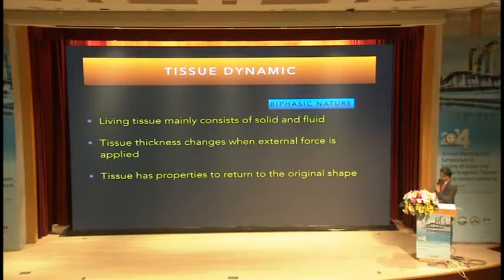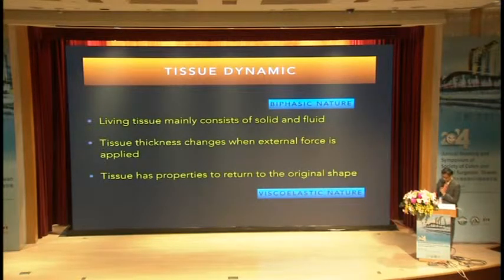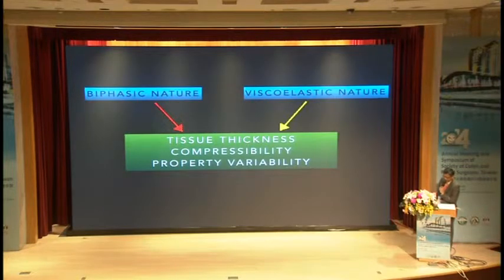Tissues are able to return to their original shapes. We call it viscoelastic nature. Based on biphasic and viscoelastic nature, we have to consider the tissue thickness, compressibility, and property variabilities when we use the staplers.